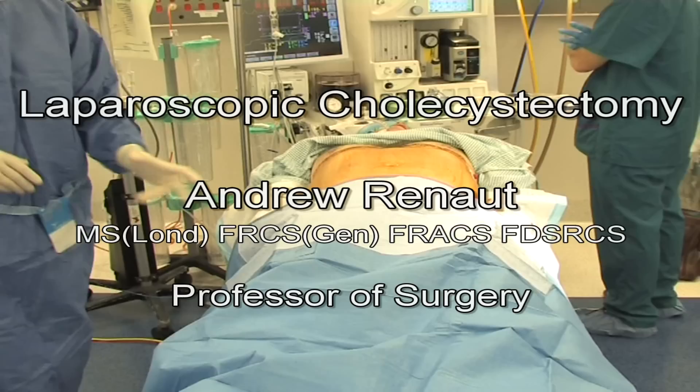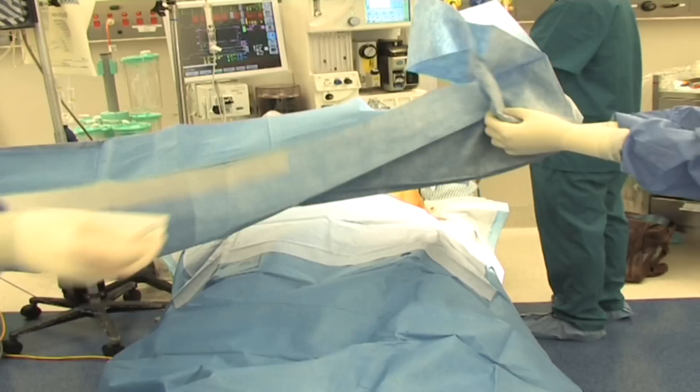A laparoscopic cholecystectomy, otherwise known as removal of the gallbladder using keyhole surgery, is performed under general anaesthesia. The patient is prepped and draped in the usual fashion.